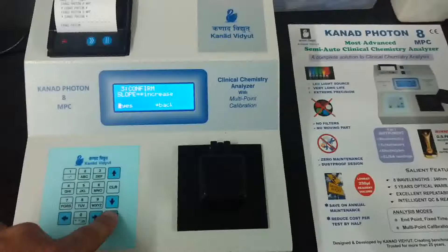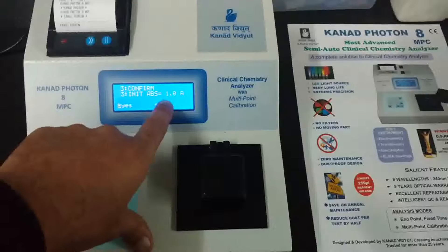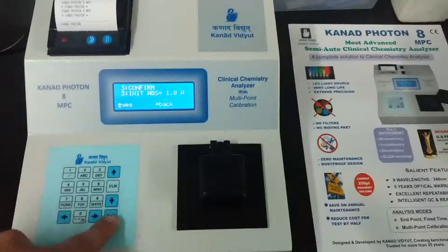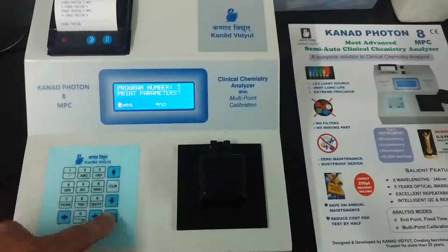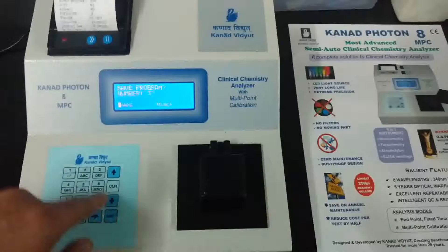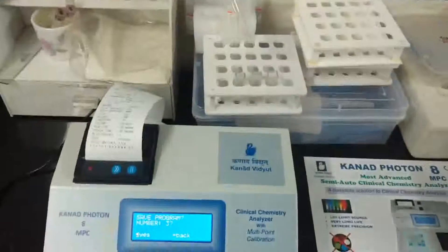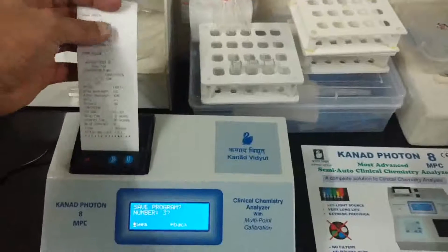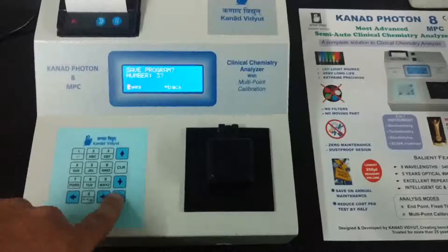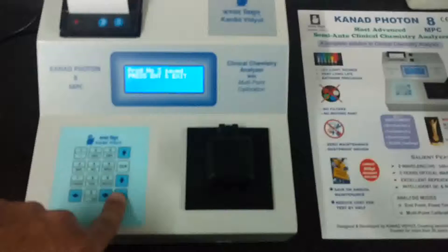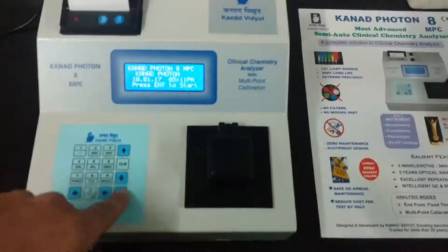If the reaction is increasing, select increasing reaction. For the initial absorbance limit, by default it is set to 1.08, but you can also select 0.8. If you select print parameters, the parameters will be printed showing the test list. We will select yes, then press Enter to save and exit. We are now back at the main screen — press Enter to start.